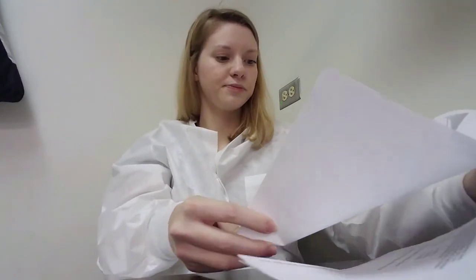And then saturation is 89, oxygen saturation. So they have just the answer being metabolic alkalosis, which is partially compensated because the pH is increased, the CO2 is increased, and the HCO3 is increased.